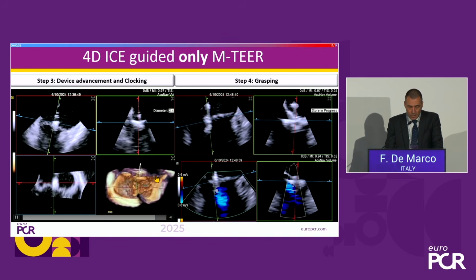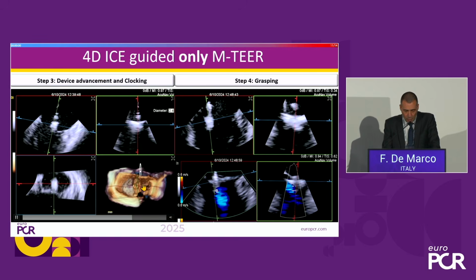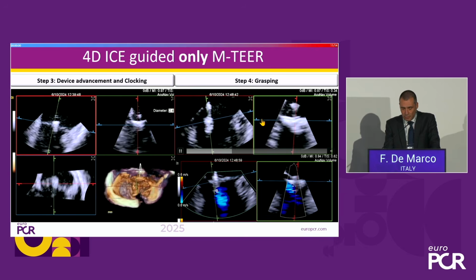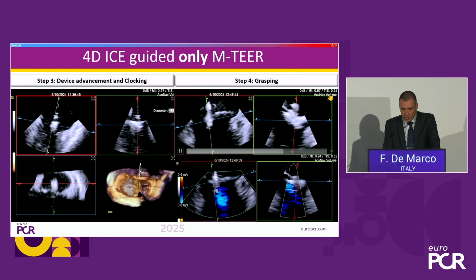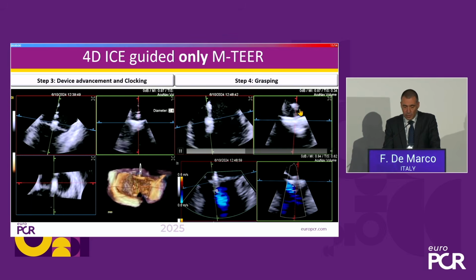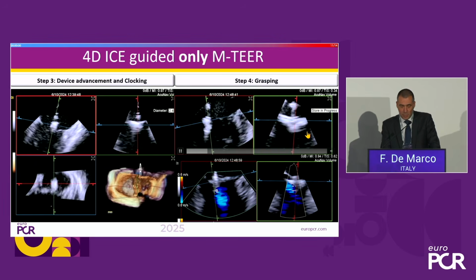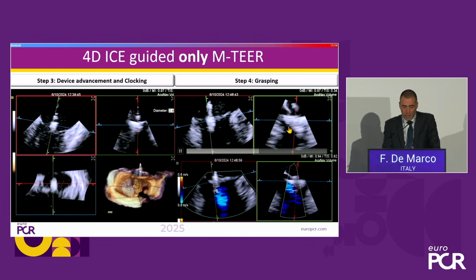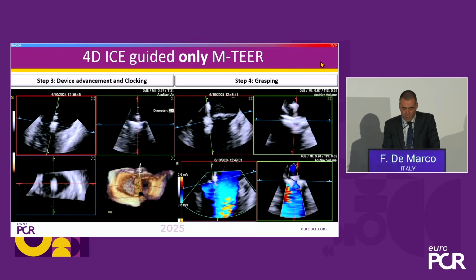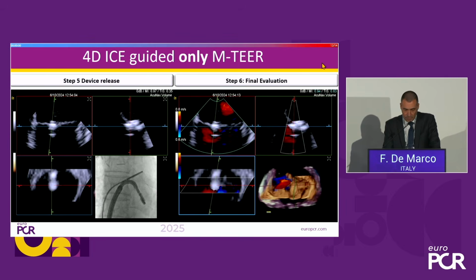We confirm the positioning of our Pascal above the mitral valve in the intended location. We advance it across the mitral valve, and you see this was the previous generation of the Acunav catheter, the volume and not the Lumos. So here the image volume is a little bit smaller, but still it can provide very nice images and confirm an effective grasping of both mitral leaflets.